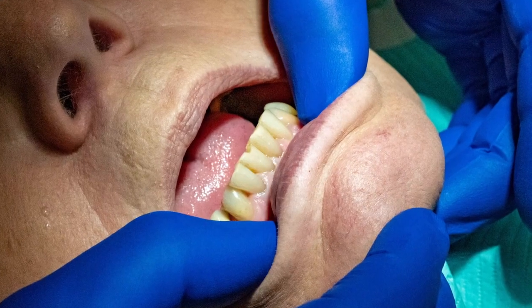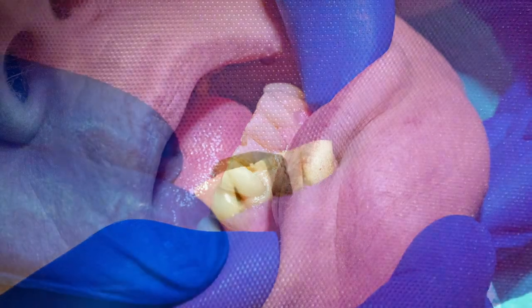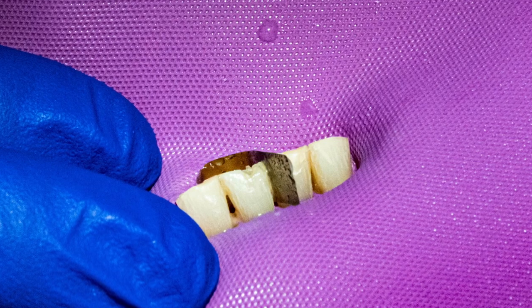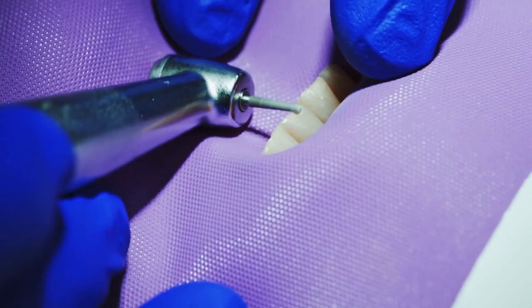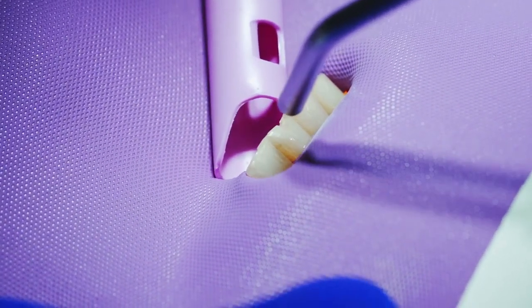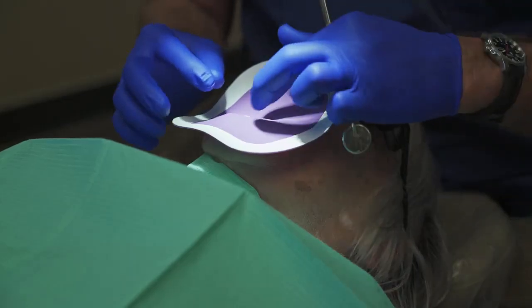We're going to fix a problem that we deal with in dentistry, which is the chip of an anterior tooth. I've developed a product that is designed to anchor the filling into position. We will clean the space, rinse it, then use a clear matrix to isolate the area.